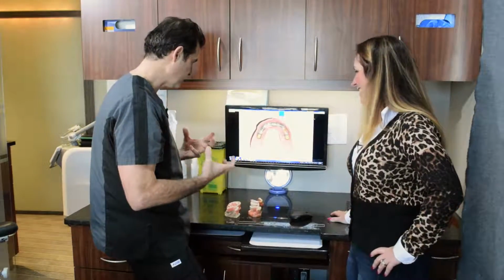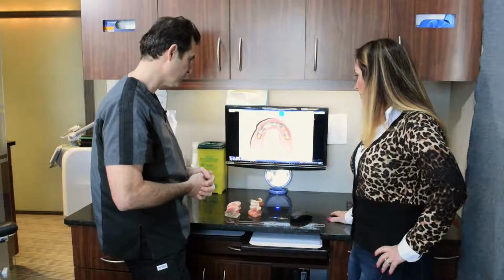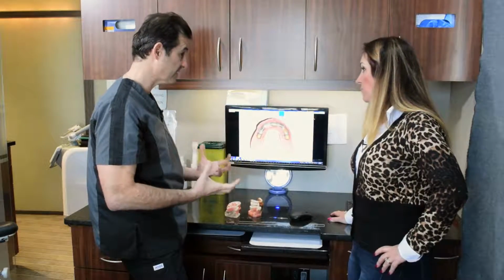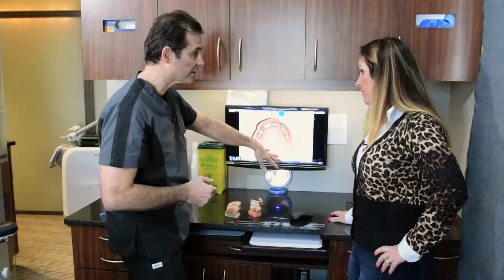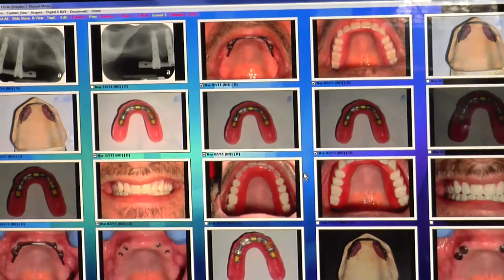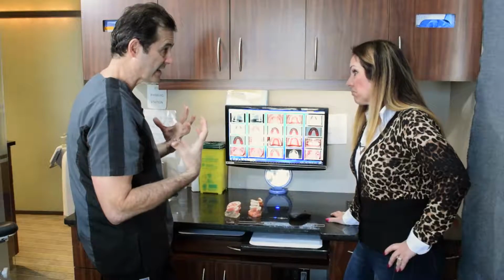So that's the main difference: when you have one of these implant supported overdentures like this with the bar, people are chewing very, very hard again because it's implant supported. And so they can actually crack the denture. To prevent that, we make a metal framework inside this denture, which is going to help give it the strength that they need to withstand the new chewing forces that they're going to be applying. Right. And of course, that will help support your facial musculature because you can eat again.